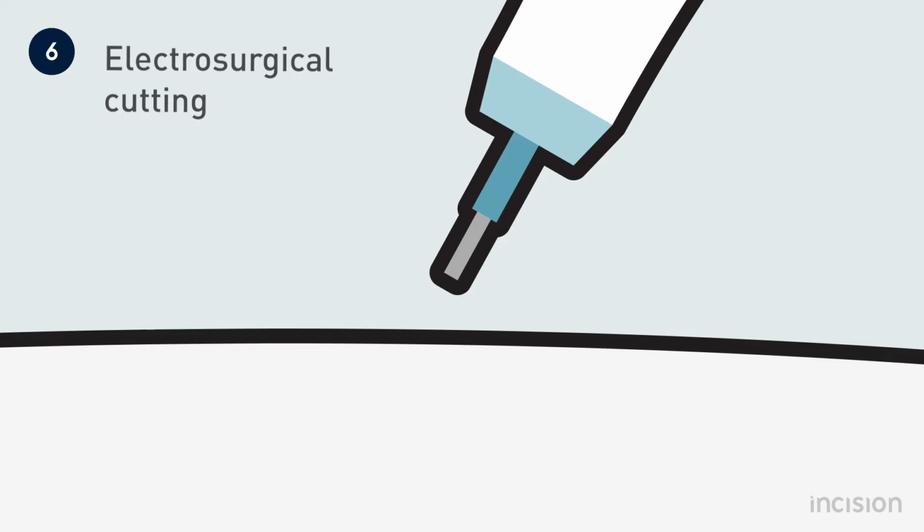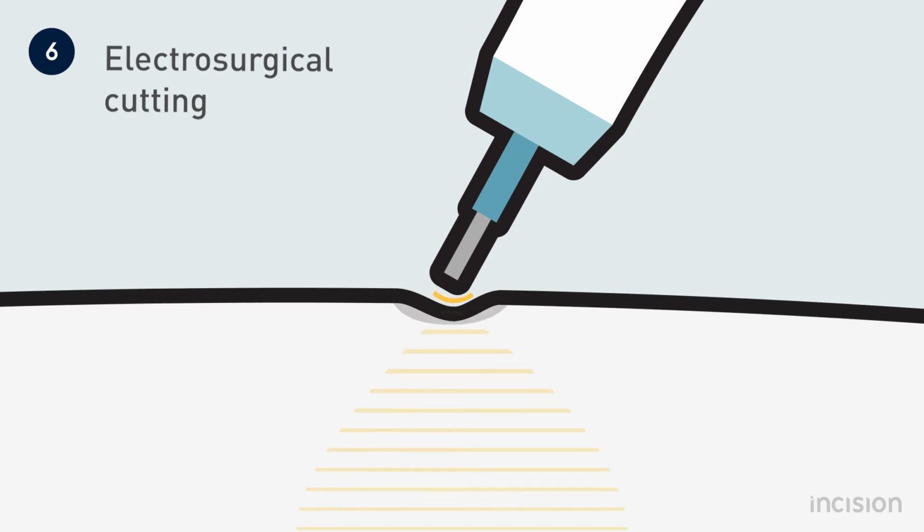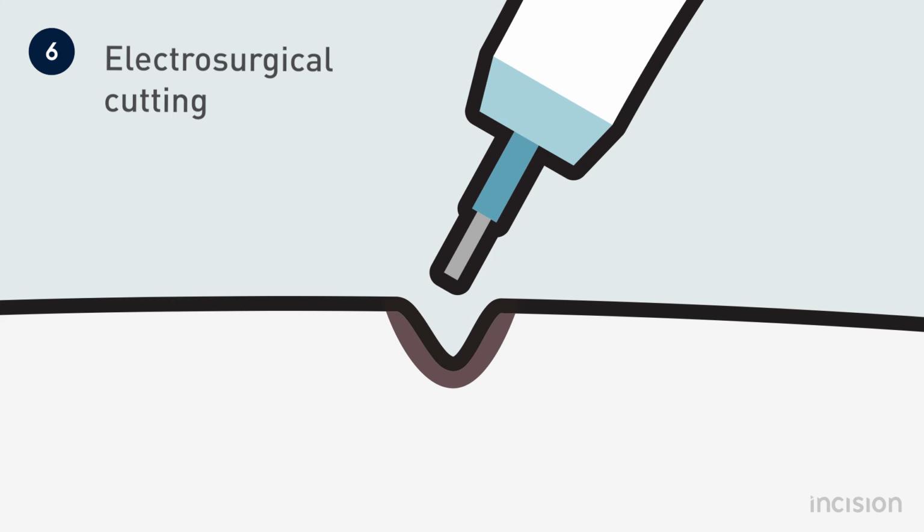The main advantage of electrosection over scalpel surgery is the ability to achieve simultaneous hemostasis for smaller blood vessels by using a blended waveform.